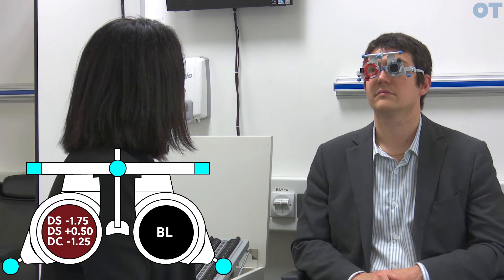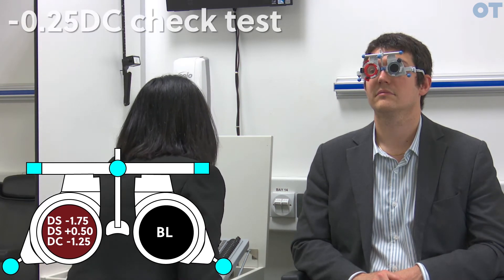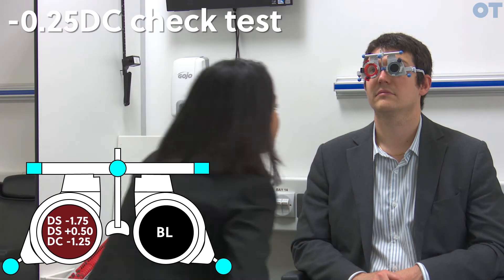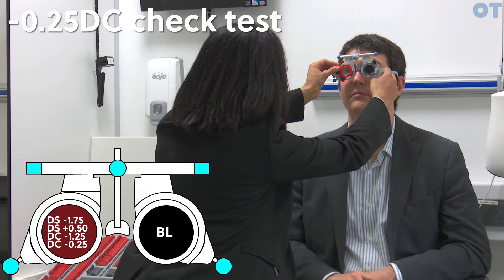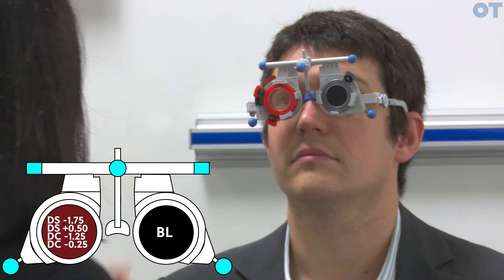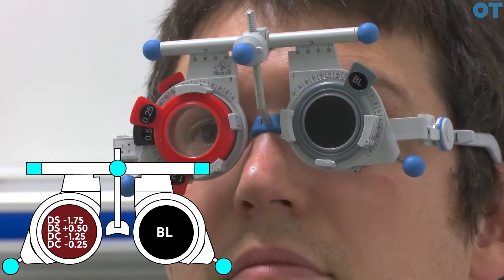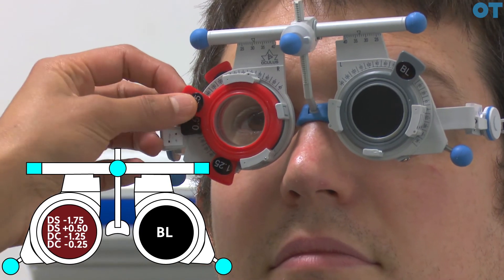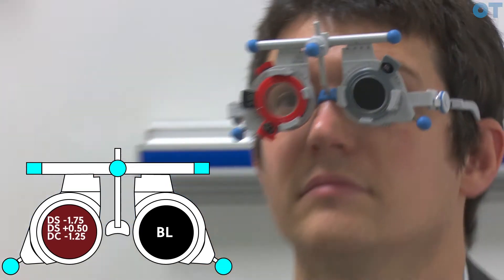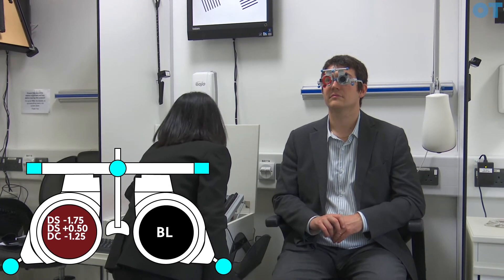We'll now do a check test to ensure this is the right power. The check test involves putting a minus 0.25 CYL on top of this prescription and asking the patient how the clarity of the blocks appears. Do the blocks still look equally clear or is one clearer than the other? The ones on the left look clearer. That's the correct answer — it suggests we've over-minused the patient on the CYL, confirming this is the correct prescription.